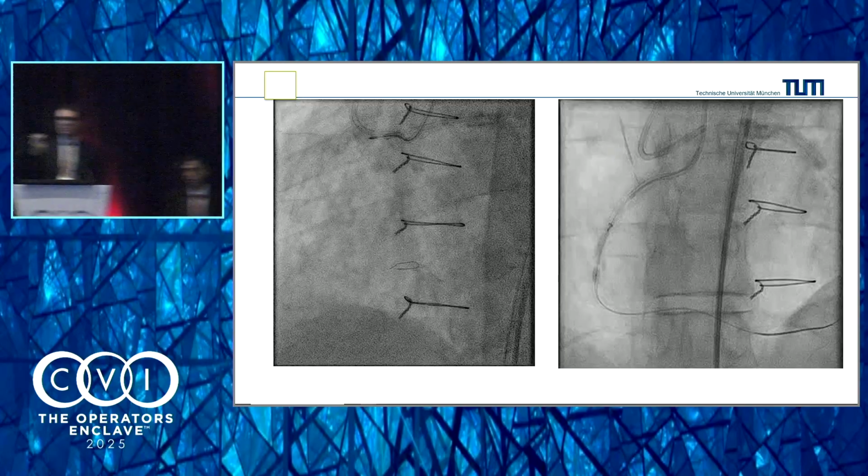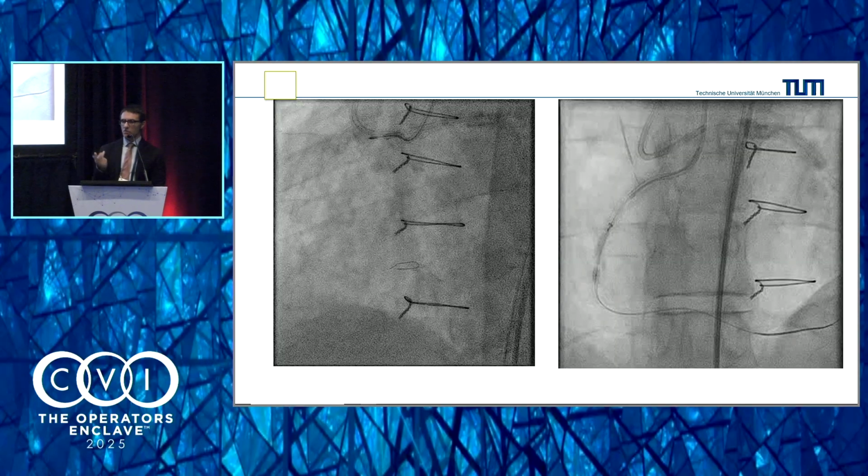No, it's not an angiogram. It's just a check with a little bit, 3 milliliters, of contrast to see if you can see the extravasation from the artery or not. Check for perforation. Because all the time I hear just that it's the perforation. The perforation is really rare, but just to make beginners a little bit more confident with going to high pressure, please don't go straight to high pressure. Try to modulate your high pressure and check every time and keep the pressure there. Don't be afraid. The balloon has an incredible resilience.